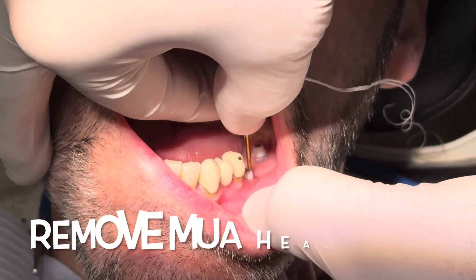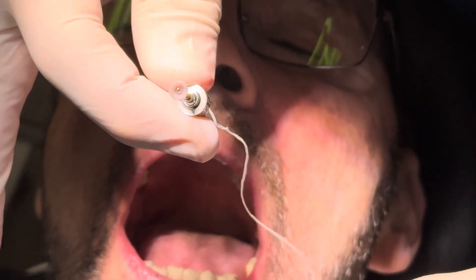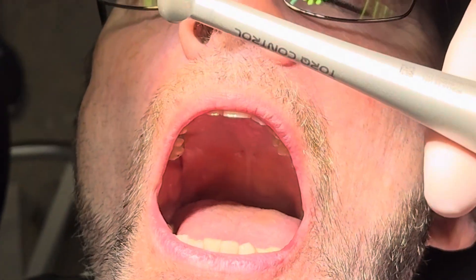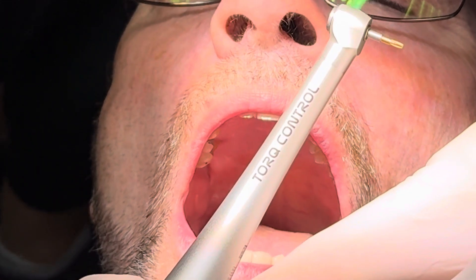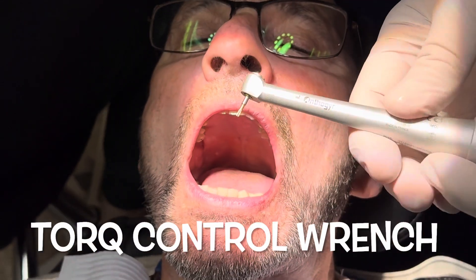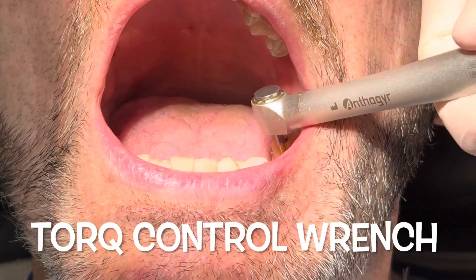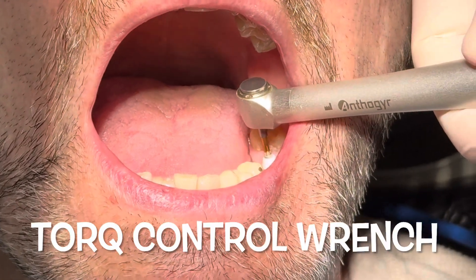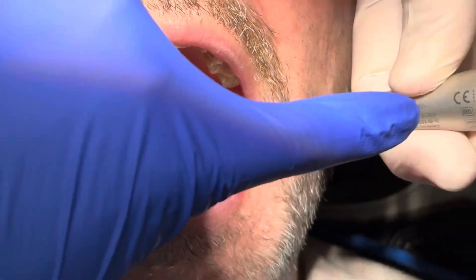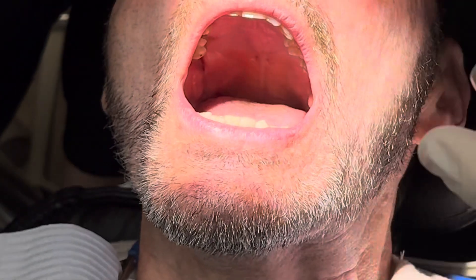Our goal now is to insert the bridge, so we take off the white healing caps on the multi-units to expose them. By doing so we can get in there in the posterior with the torque control wrench, which is one of my favorite instruments for bridge work. We use it to unscrew the healing cap, exposing the multi-unit abutments so we can start to insert the bridge.